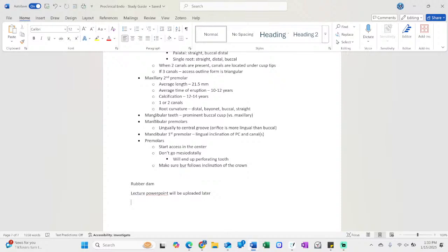Originally they were manufactured from latex, but now ours are non-latex, to avoid any allergies. Like I mentioned, they come in various colors and thicknesses. You can decide what is best in your hands. Everybody likes a little bit different one. Obviously, if it's a little bit lighter, it's going to be stretchier, but it's going to tear a little bit easier. The heavy ones will be a little bit more durable, but sometimes a little bit harder to maneuver.